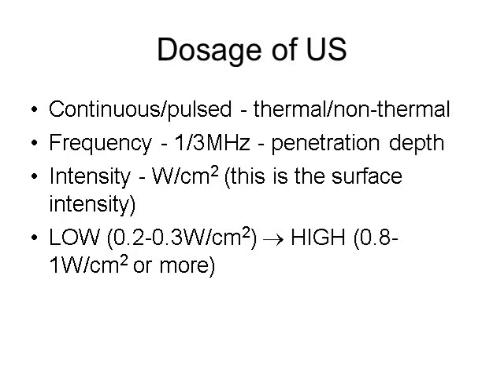Low intensities will obviously be employed for very acute injuries, with the intensities used gradually increasing with chronicity of the condition. The reason being that acute injuries may be easily aggravated, and therefore low ultrasound intensities are used. For chronic conditions, higher ultrasound intensities are used to effect a change in the physiological state of the healing process.